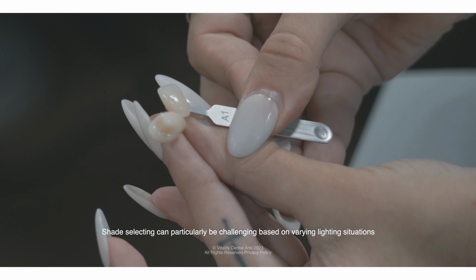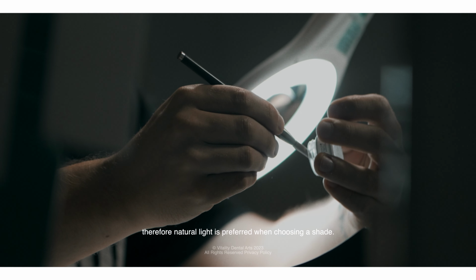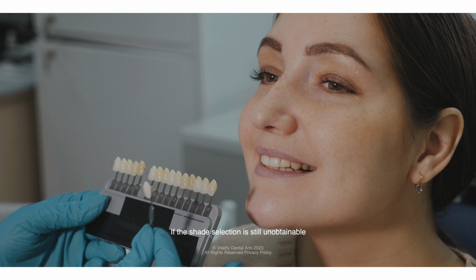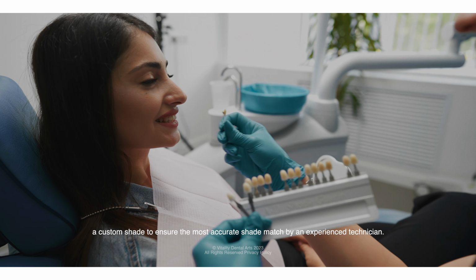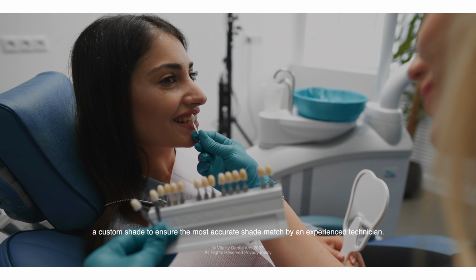Shade selecting can particularly be challenging based on varying lighting situations. Therefore, natural light is preferred when choosing a shade. If the shade selection is still unobtainable, it is highly recommended the patient comes in directly to undergo a custom shade to ensure the most accurate shade match by an experienced technician.